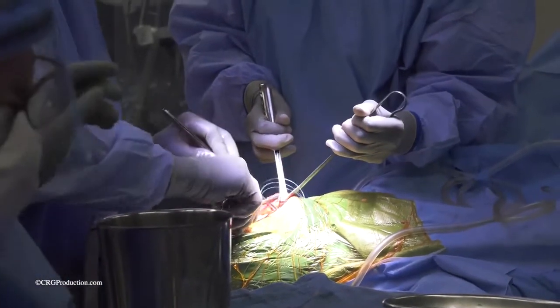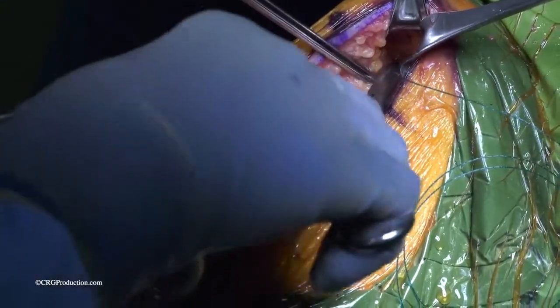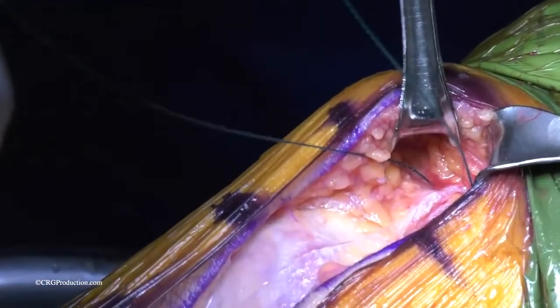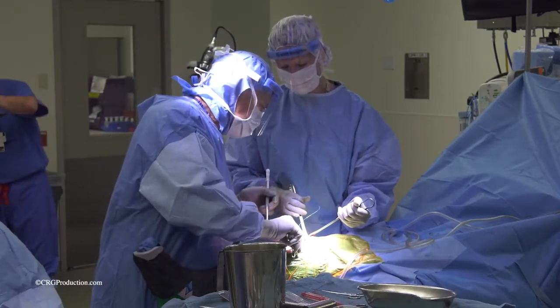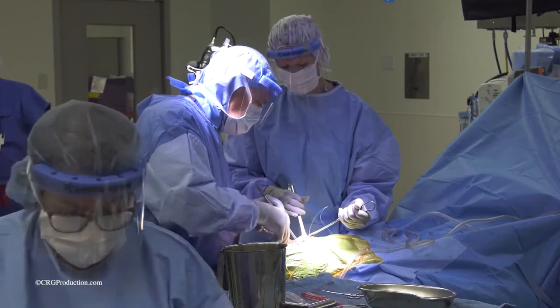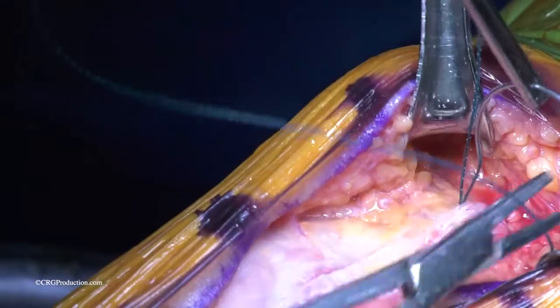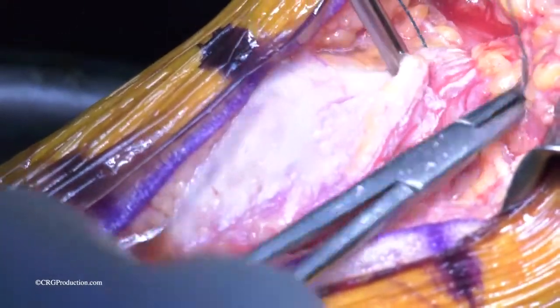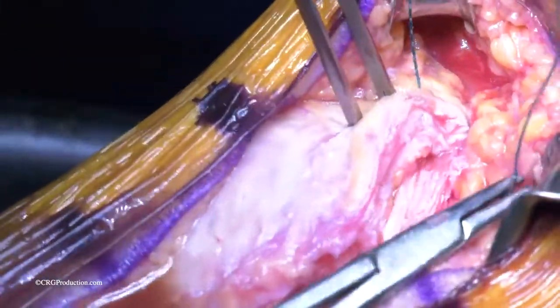You may remember talking about the fascia. The fascia is now closed with a heavy-duty suture. This heavy-duty suture has small barbs on it. You can see the irregularity of the suture. And as this is inserted into the fascia, it'll actually hold all the tissues in place. So when a patient is bending their knee, they have no reason to worry about the knee coming apart or opening up. This is called closure of the knee.